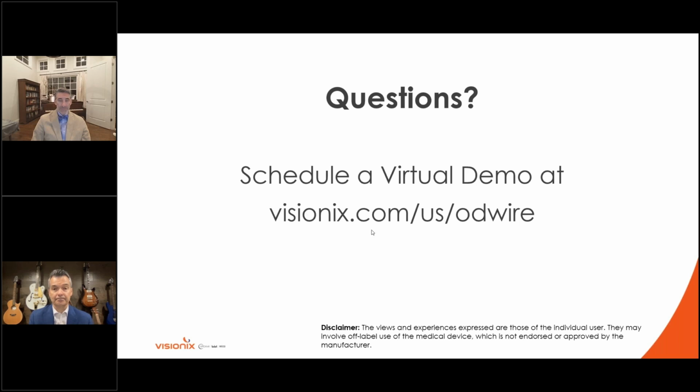And a related question, about remakes. How frequently do you have to remake a lens, and what's the turnaround time usually when it happens? To remake a scleral lens? Yep. It depends on the lab that you're working with. Every single lab has a little bit of a different time frame, but we're pretty good at getting our lenses within 7 to 10 days from when we order them. Then it depends on the patient.